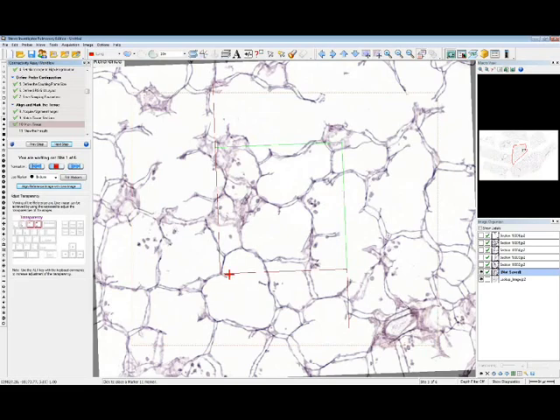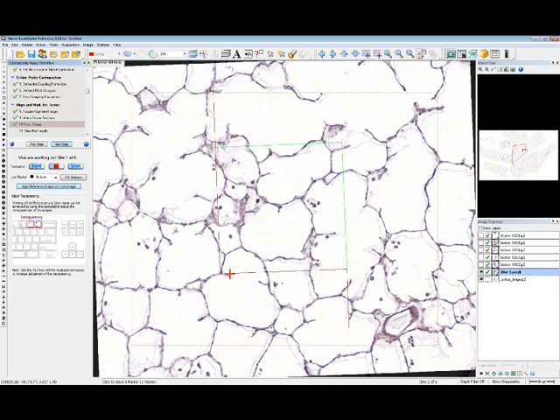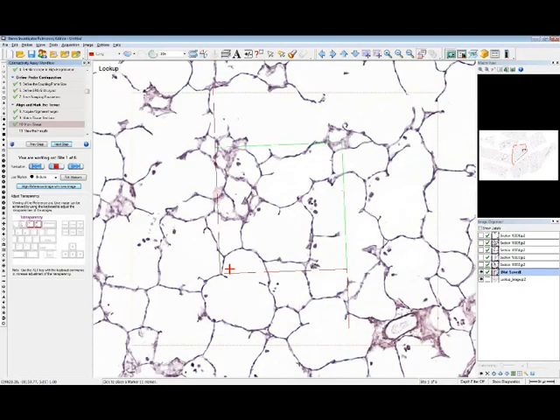And we have a couple of ways to do this. One of them, we can change the transparency of the images, so we can look at the overlay. And another option, you can actually switch between the two images, which is often what I prefer to do. And sometimes you'll need one method versus the other, or both. So let's switch back and forth a little bit.